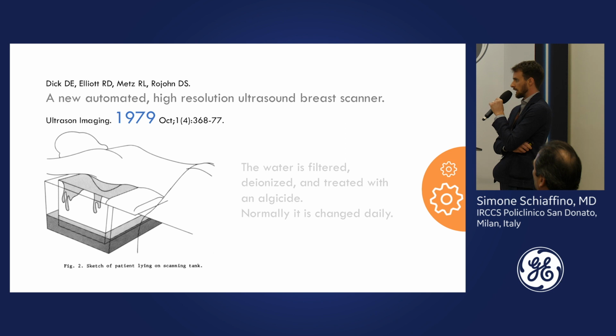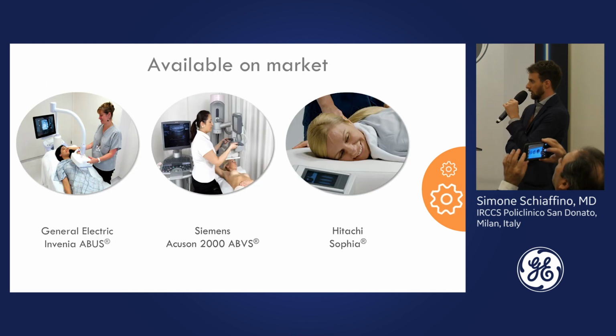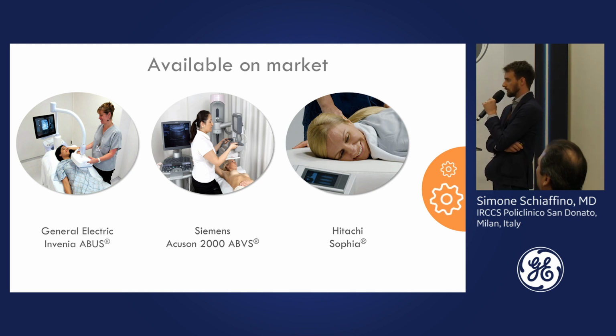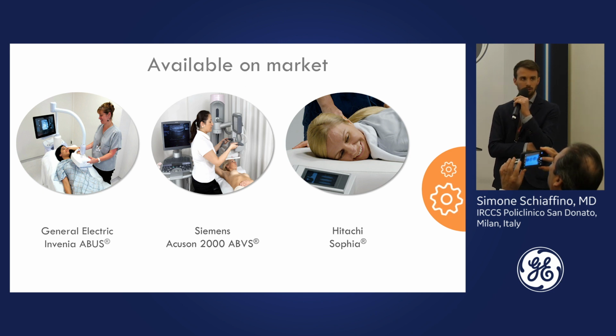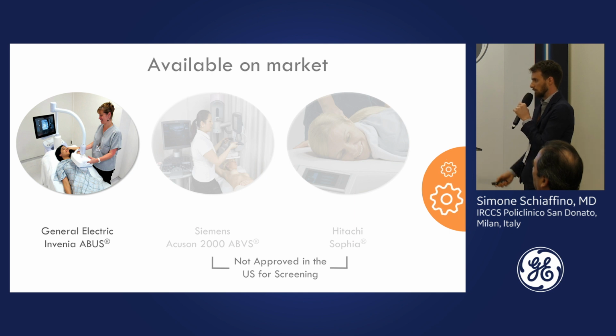Here you find the main machines available on the market. The patient lies supine or prone, depending on the different vendors. These 2 machines are not approved in the US for screening till now. I don't know if we have to update it. Maybe they still are not available for the screening setting.